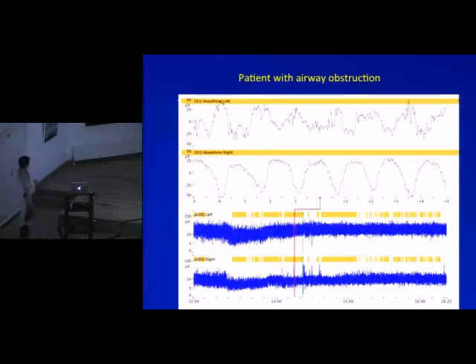This is another baby which mimics the seizure patterns. And the seizure detection is showing seizure patterns. So you really have to be aware when your seizure detection suddenly shows up, what is happening. And this baby was breathing, had an airway obstruction and moving all the time like this. And that's what happens when, for instance, nurses are patting the back of the baby just to reassure them, and they can mimic seizures. Or you have a child on the ventilator that can have a similar pattern with the frequency of the ventilator looking like a seizure pattern. So that can be difficult.